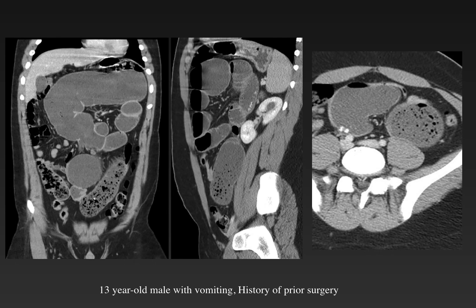Here we have a 13-year-old male with vomiting and a history of prior surgery, and we see the small bowel fecalization sign. This refers to dilated distal bowel appearing to contain fecal material, and is often seen at the most distal point of obstructed bowel, just proximal to the site of obstruction. Here we can see a sharp transition zone right distal to the fecalized bowel as a result of adhesions in this postoperative child.